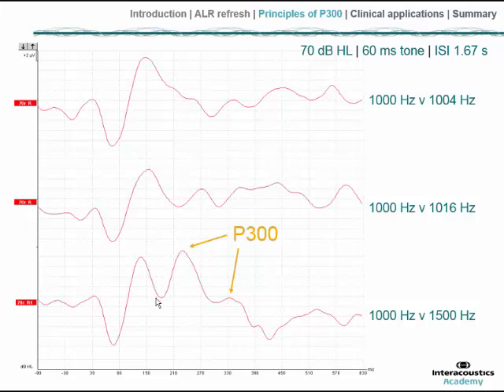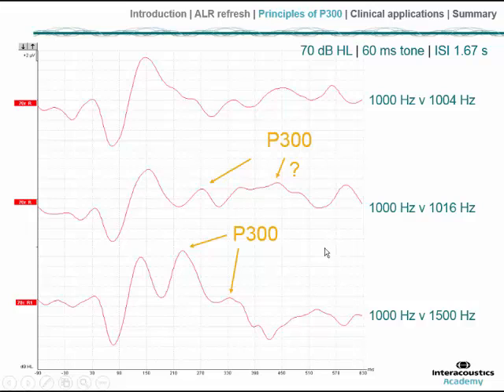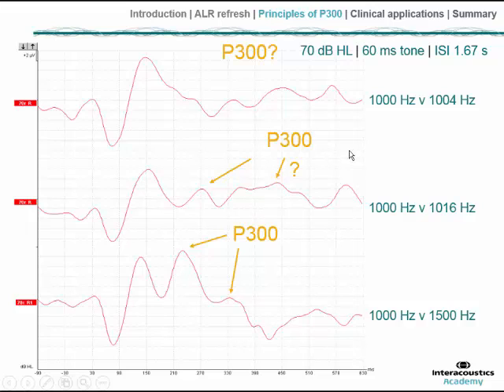Shifting attention to the middle trace, where the discrimination task is somewhat harder — the target oddball is now 1016 Hz against a 1000 Hz standard, so much closer in frequency — we see what appear to be later and smaller versions of the P300. In the upper trace, with an even harder discrimination task using 60 ms tone bursts, it is far harder to identify any real evidence of discrimination having occurred.